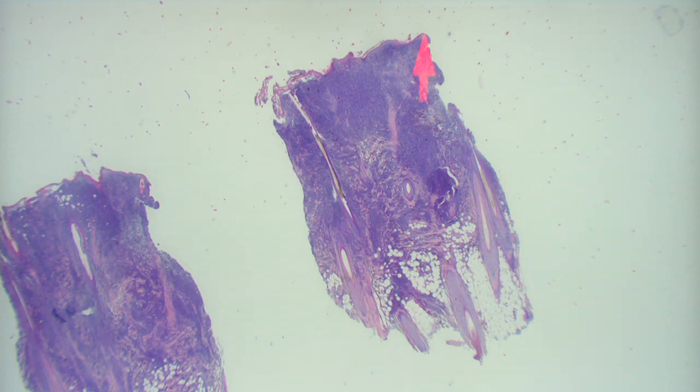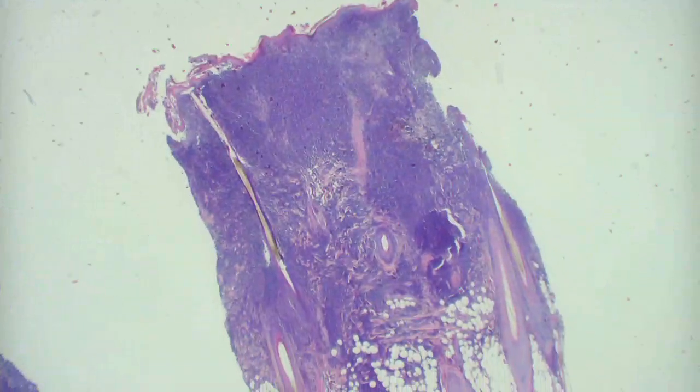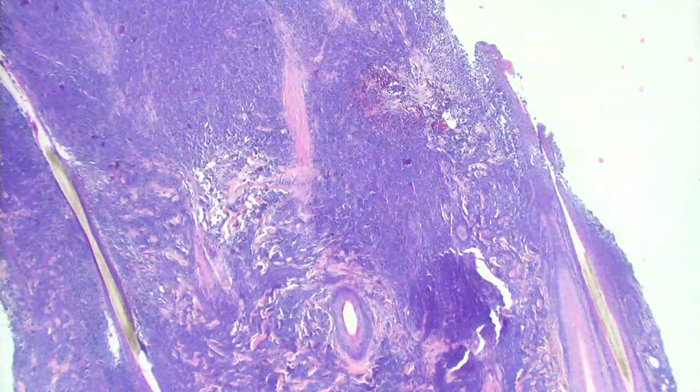It goes to the fat. It's diffuse. It's not just top heavy. There's no wedge-shaped architecture to it. So, there are a few other things that might simulate a lymphoma. Let's make sure it's not Merkel cell or something like that. It's probably not going to be. Sometimes the anaplastic lymphomas can simulate Merkel and vice versa. But when you see this pattern, the immediate reflex is this is probably lymphoma. Then at higher magnification, let's see if we can talk ourselves out of it.